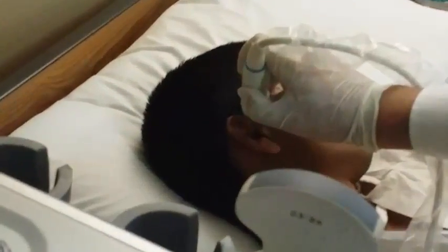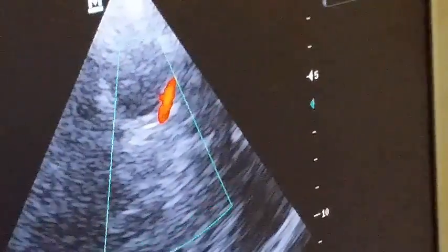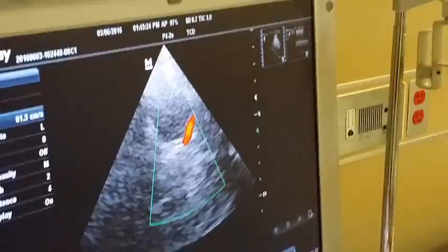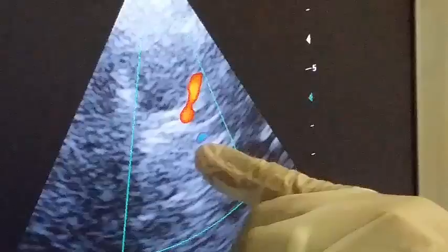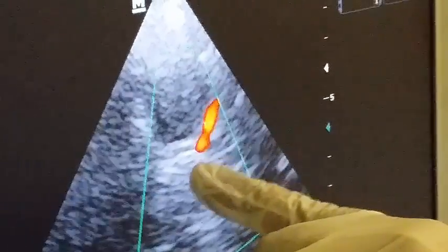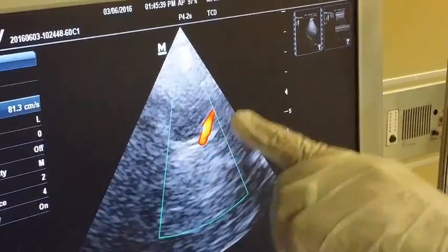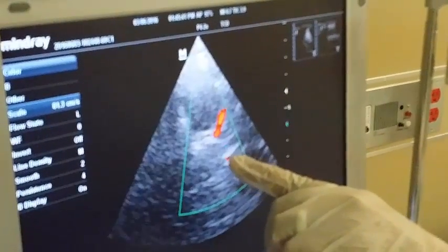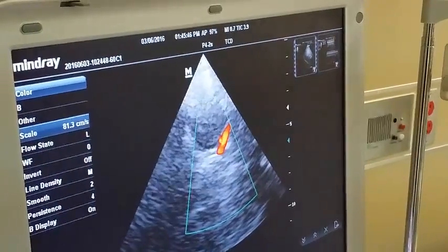It's very important — just fine tuning here to get a very clear picture of the middle cerebral artery. Now you will see here the middle cerebral artery and the anterior cerebral artery. The middle cerebral artery comes from medially towards my probe, so it appears in red because the flow is towards the probe. The anterior cerebral artery is away from the probe, so it appears in blue.